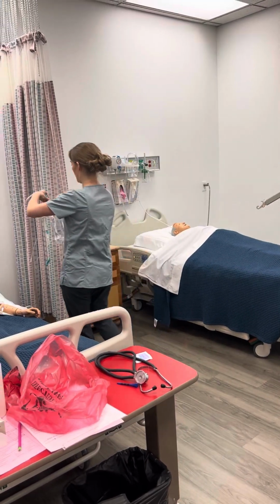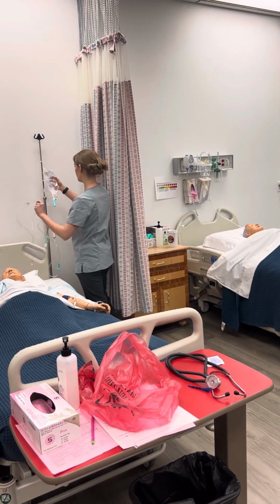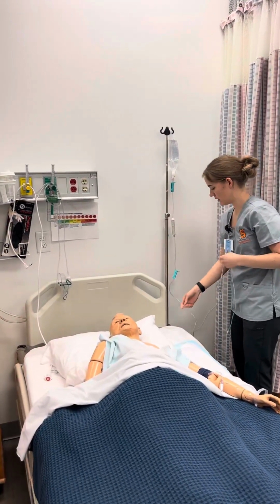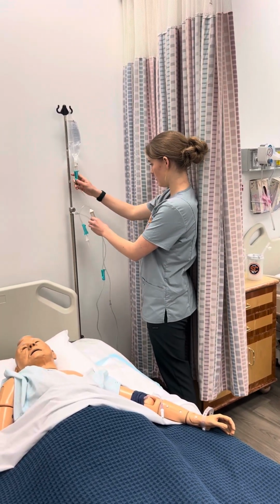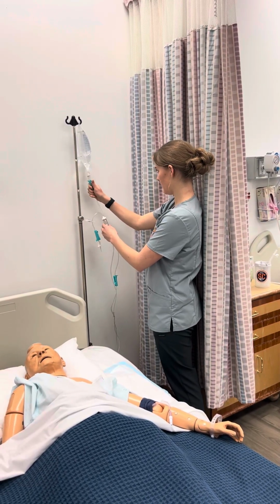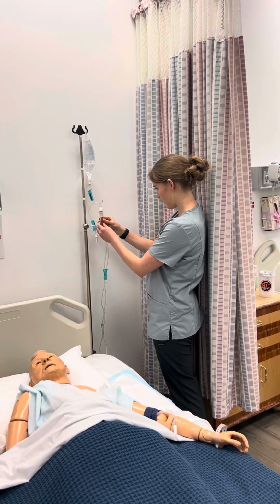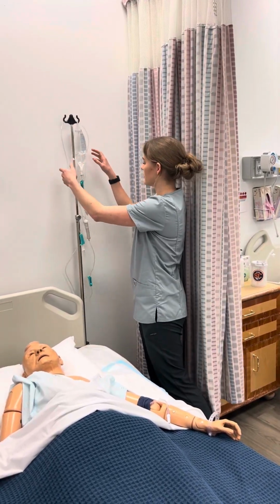Okay, I'm going to go ahead and just hang this up high. I still got everything clamped, so I'm gonna go ahead and just put this up. I'm just gonna make sure to fill all the way past that white top. Just like that. Okay, I'm gonna go ahead and prime it, which I can grab the garbage for that.